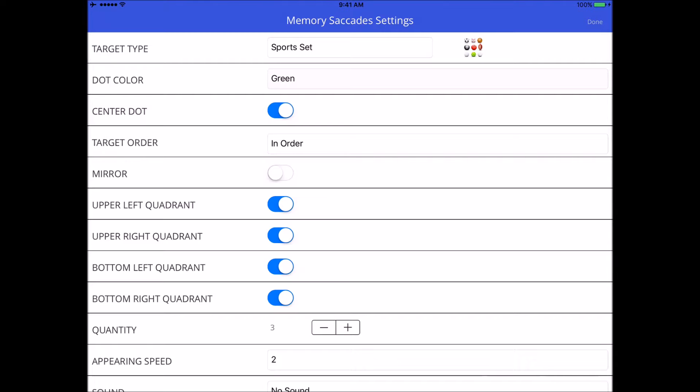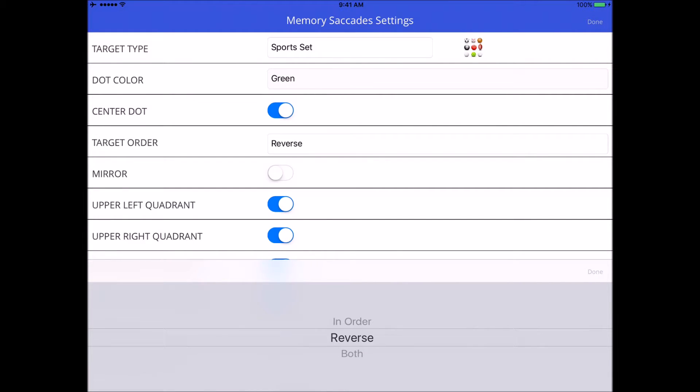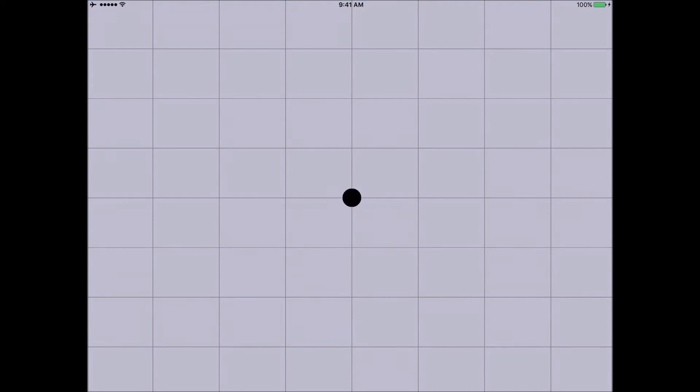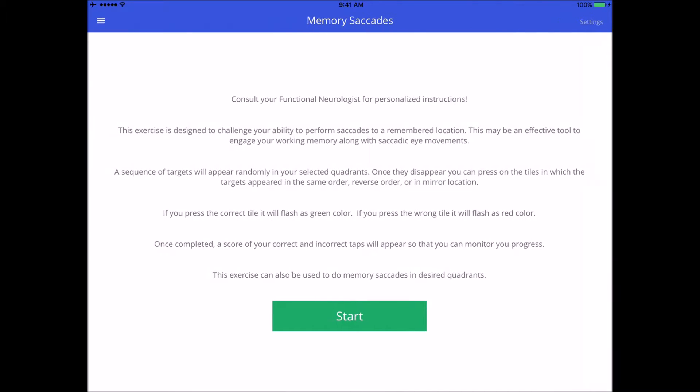I like to have my patients lead with their eyes as opposed to their finger — that's just my preference. Now let's try reverse order so you can see what that's like. I'll isolate it to the upper left quadrant. Here we go: center, first target appears, back to center, second target, back to center, third target, back to center. Now doing this in reverse order — last target first, back to center, second, back to center, first target — and I get three out of three.